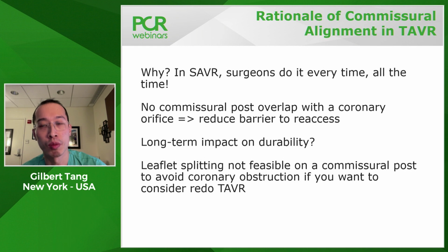So why do we do this? Well, as a surgeon, we do it every time. And that's why after surgical valve replacement, coronary access is very easy. And also TAVI-in-SAVR or valve-in-valve TAVR is relatively straightforward. If you have no commissure or post overlapping the coronary, it reduces the barrier to reaccess. It may even have long-term effects on durability.